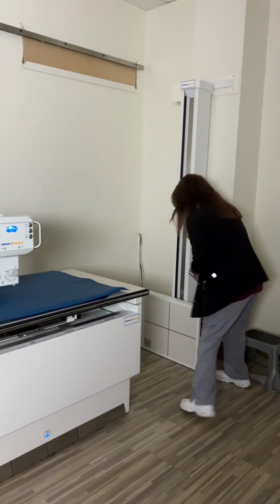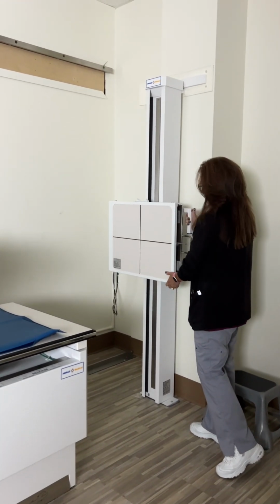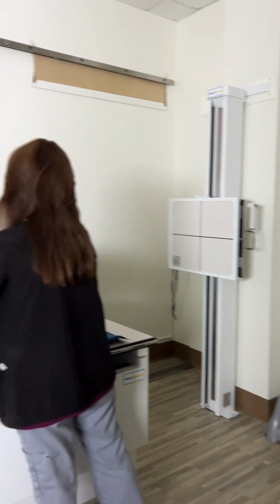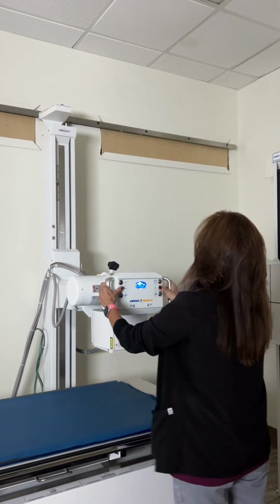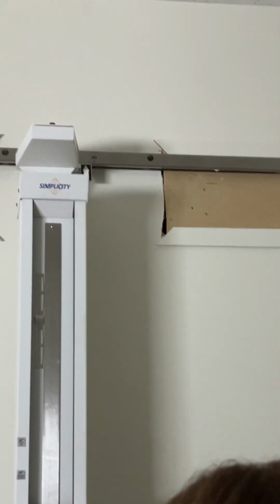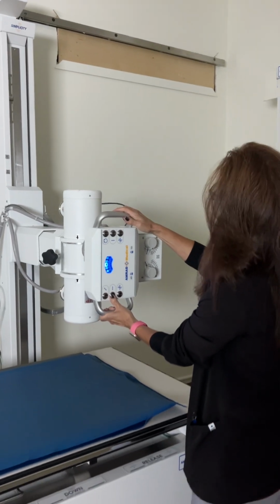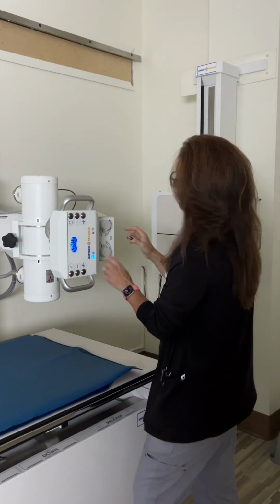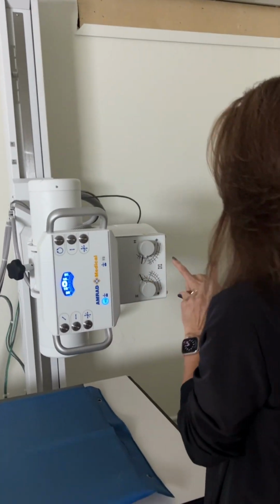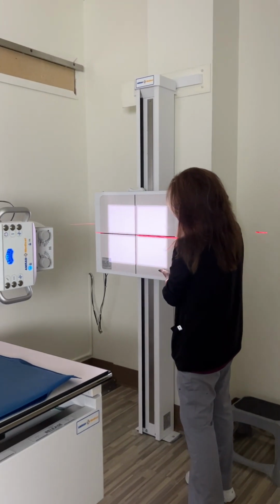Now, in the other video, we've already demonstrated how to change a patient and how to take history. So this is just positioning. So we're going to be at a 40-inch SID because this is upright. All right, so when we're at 40-inch to the wall bucky, the 40 will light up. And then my patient is a little tall, so I'm going to go up with that.